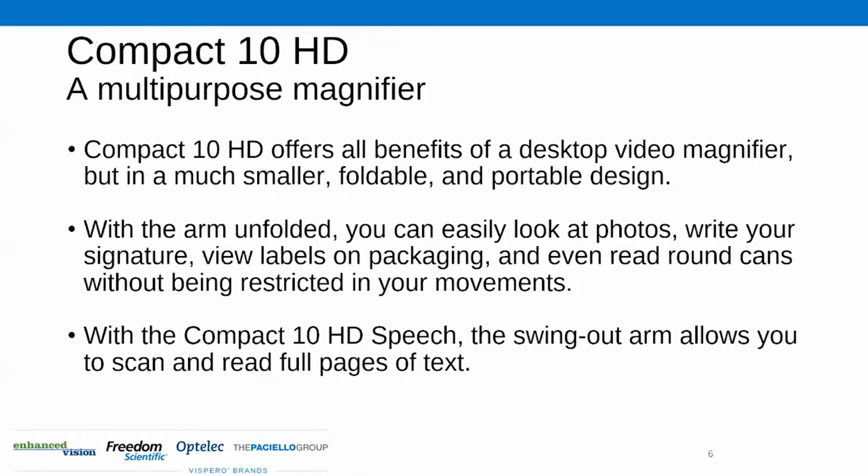And of course, the arm does double up as a very important feature to be able to provide full page OCR, optical character recognition, which, you mentioned earlier, can scan and read full pages of text. So I've always been very impressed with this device coming out the gate, and the thought process that went into meeting the various needs. There aren't many tools out there that are a silver bullet for all, but this makes a pretty good effort at it.